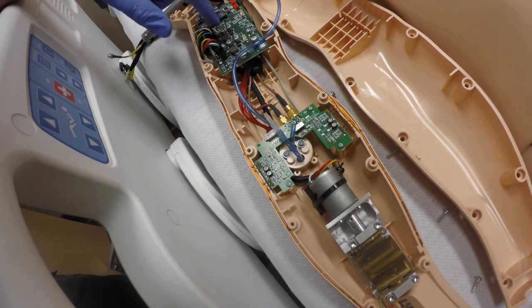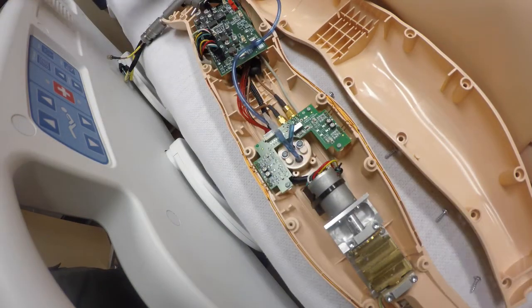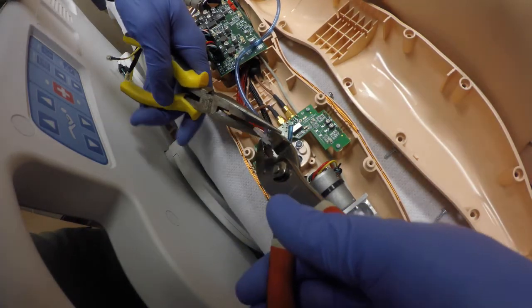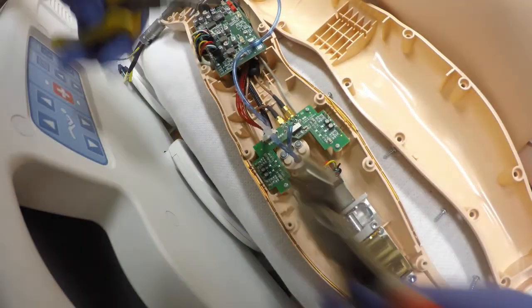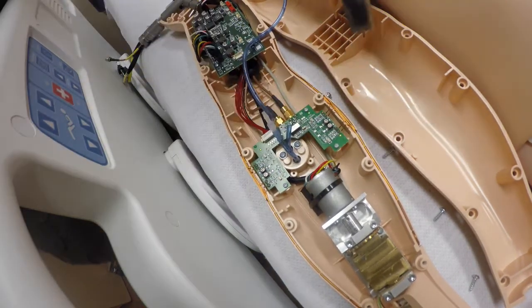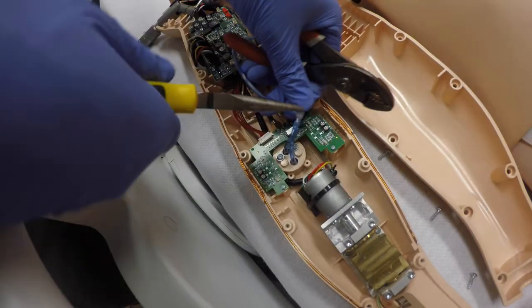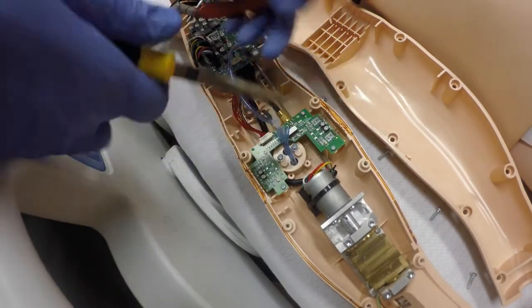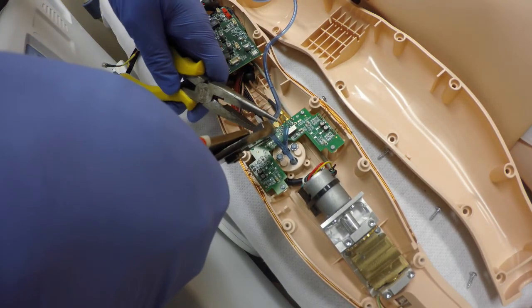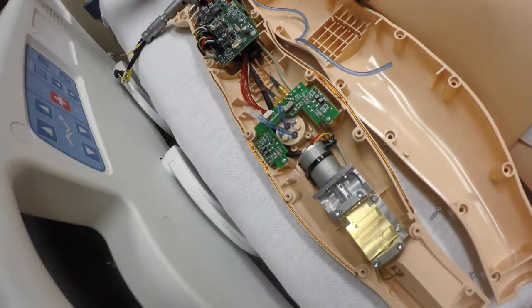If you find any residual water in here, you're going to clean it up. This circuit board here loves to get water on it and then fail, so you've got to be careful about that. We're going to do the same thing with this — just release the other part. Switch hands. There we go, that's released.